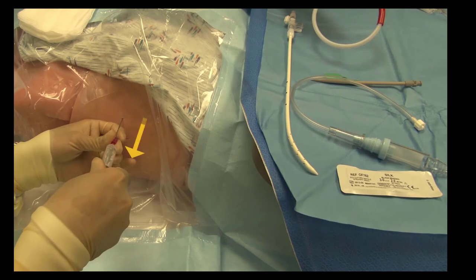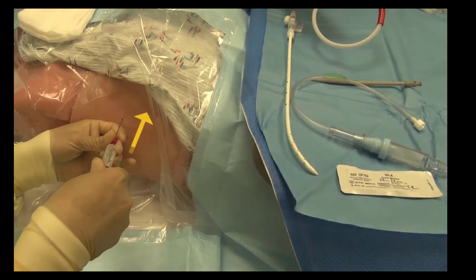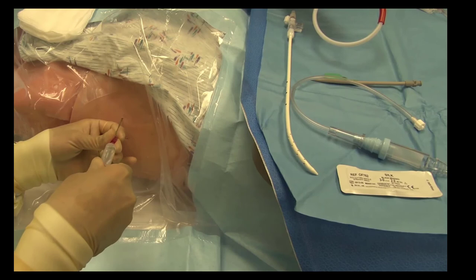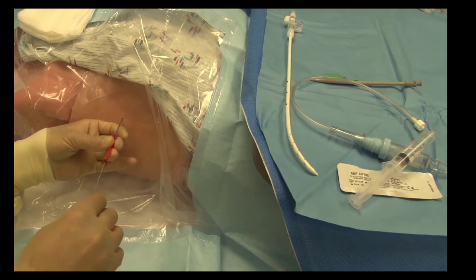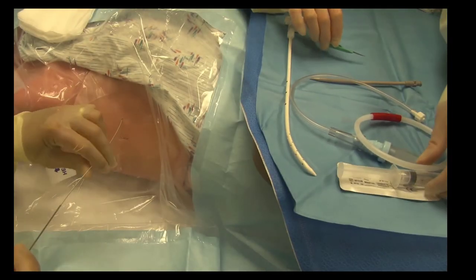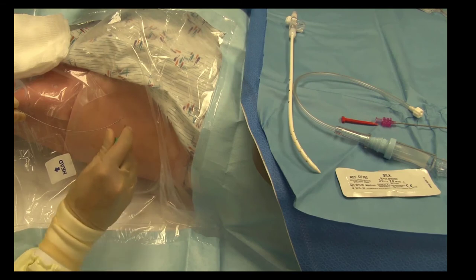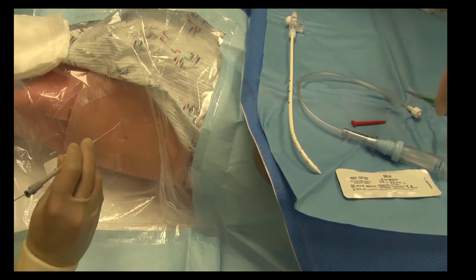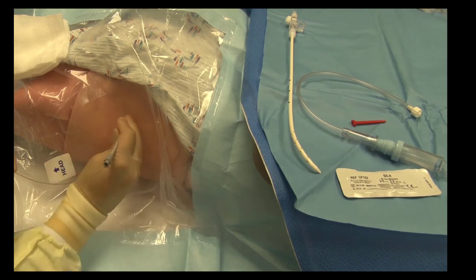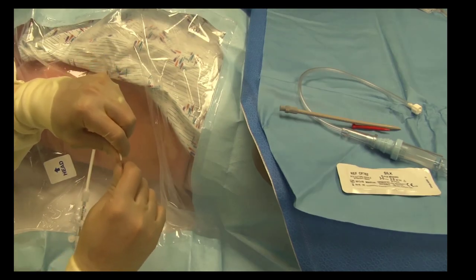In a stable patient, pull back a few millimeters and inject extra lidocaine to the parietal pleura before advancing the needle back into the pleural space. This step can make a big difference for patient comfort. Remove the syringe and feed the wire through the needle until there is about 10 centimeters left. Remember, your needle should be oriented cephalad, so the wire will feed toward the lung apex. Remove the needle and make a 1-centimeter incision by inserting the scalpel to its hub. Insert one dilator the necessary depth, based on how much subcutaneous tissue you estimated by ultrasound and then confirmed by needle depth. Slide the dilator in and out a few times using a twisting motion to ensure it moves freely, then remove it and feed the catheter with trocar in place over the wire.